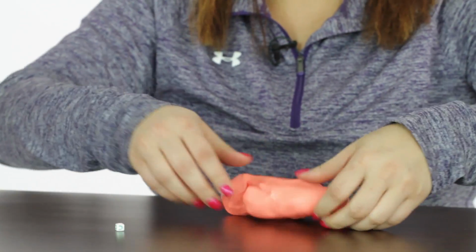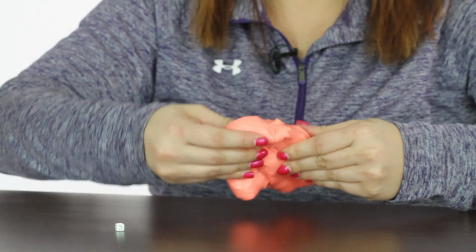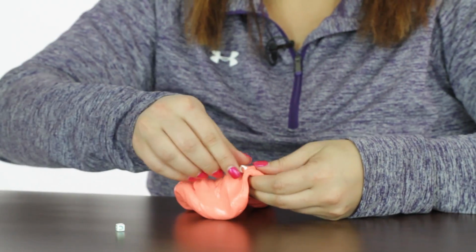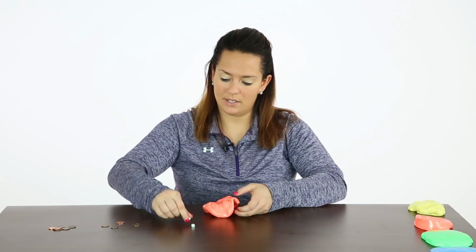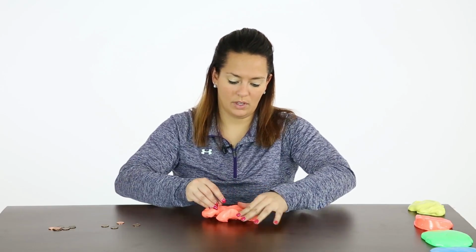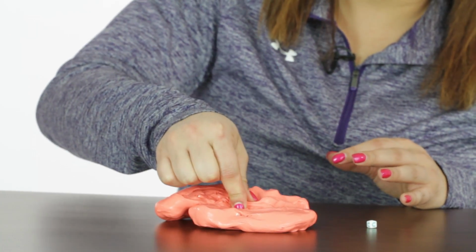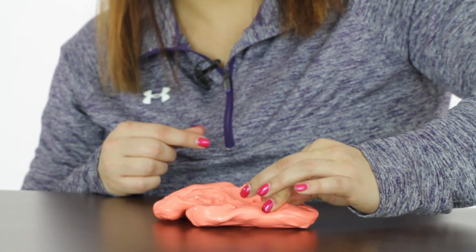These have letters on them if that's a skill that you're working on. You could also hide just colored pony beads that you make necklaces with. So just really digging, finding all these different beads. And then to hide them requires strength too, so we're going to push them down and really pinch them back in there to hide them for the next time. So pushing and pinching.